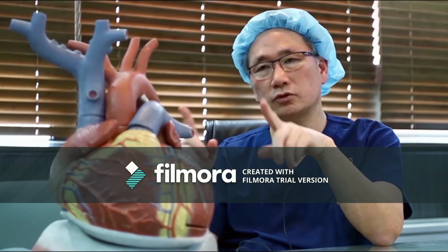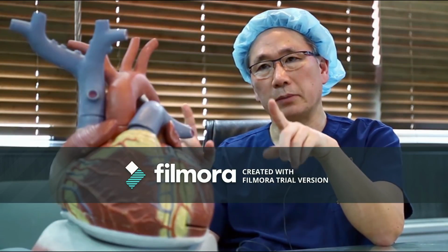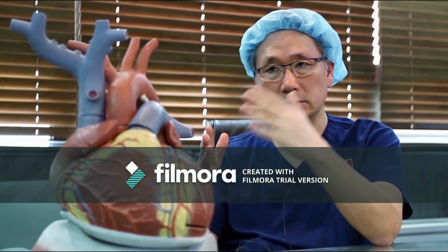At least we pace inside the PV to see the exit block.